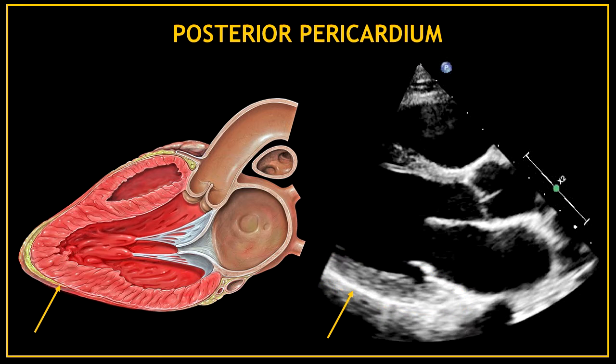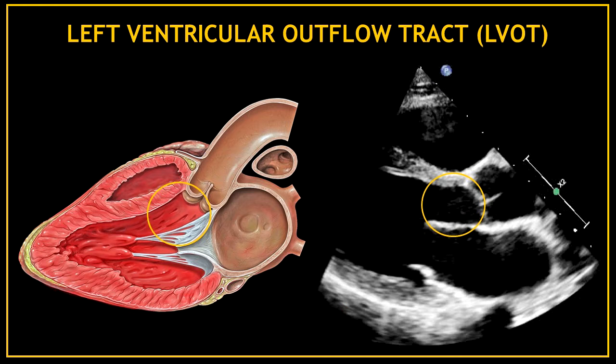After the posterior wall we can visualize a very thin bright white line. That line corresponds to the posterior pericardium. This smaller area in the left ventricle is called the left ventricular outflow tract, or the LVOT.